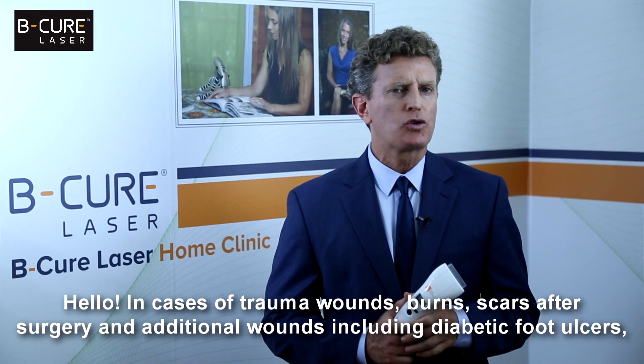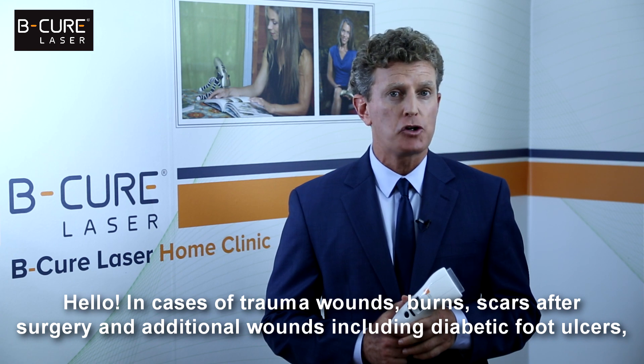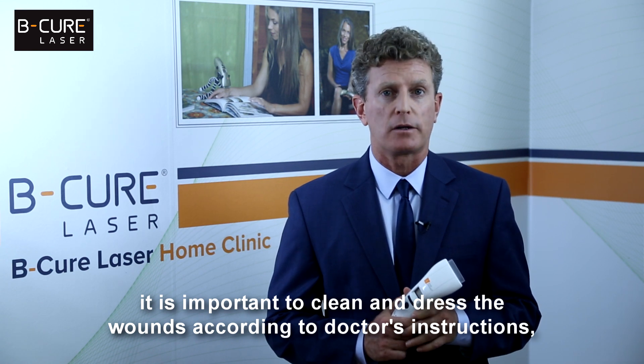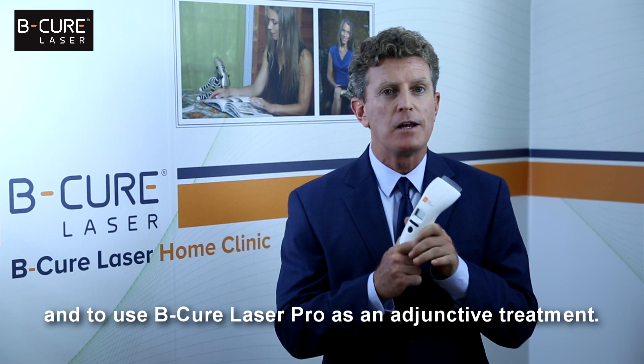In cases of trauma wounds, burns, scars after surgery, and additional wounds including diabetic foot ulcers, it is important to clean and dress the wounds according to doctor's instructions and to use BeCure Laser Pro as an adjunctive treatment.